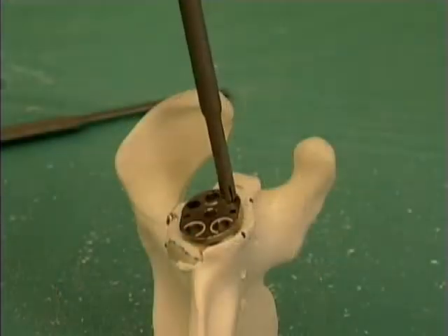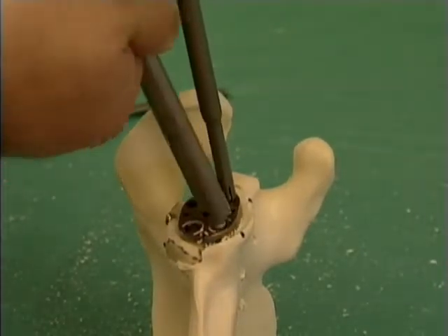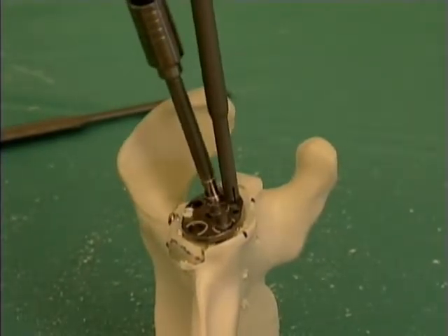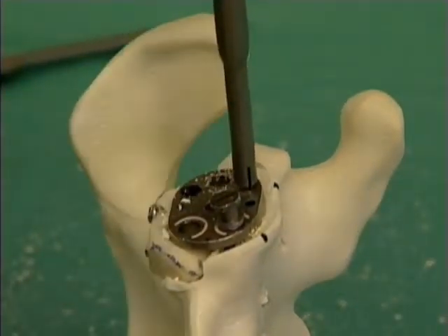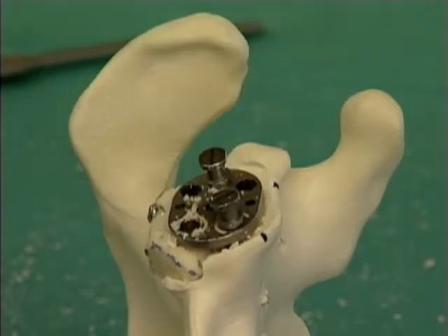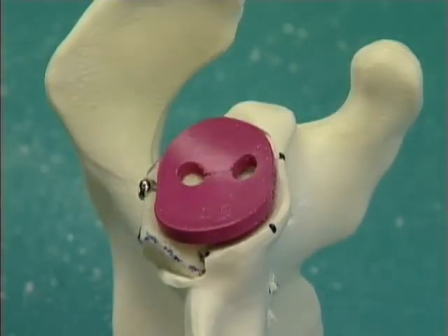This is followed by placement of the peripheral three holes using the instrumentation provided by the manufacturer. A derotation peg is placed in the anterior hole and the superior hole is drilled with an additional derotation peg, and finally the posterior hole is drilled. Once completed, the surface has been prepared for placement of the trial component, which is inserted and impacted showing excellent backside contact.